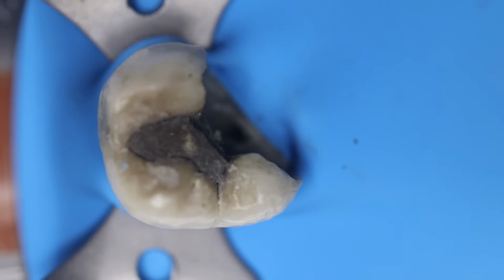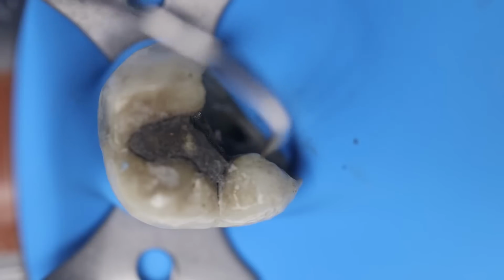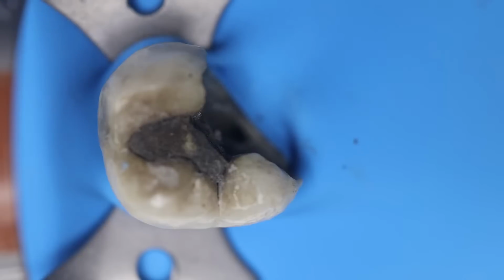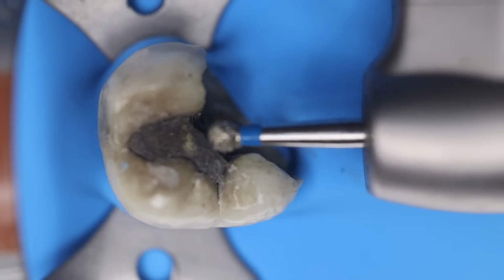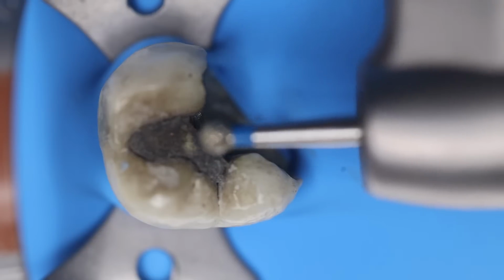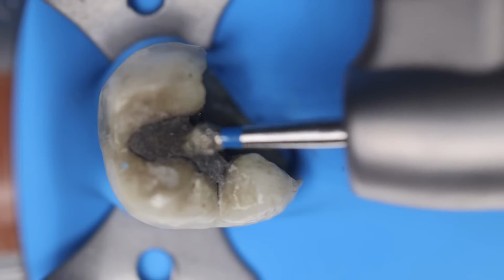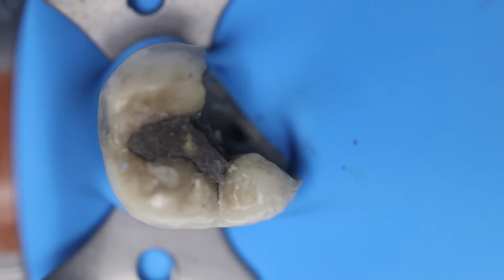So once we visualize the tooth, the first thing that we should do is always approach from the center of the tooth, and remove the restoration, the caries and the weakened tooth structure. For that, we would be using a round diamond bur. Just forget about any access opening kits or whatever we have, just simplifying things for this complicated tooth. So we can begin with a big diamond round bur, whichever company you prefer. Okay, now let us begin slowly.